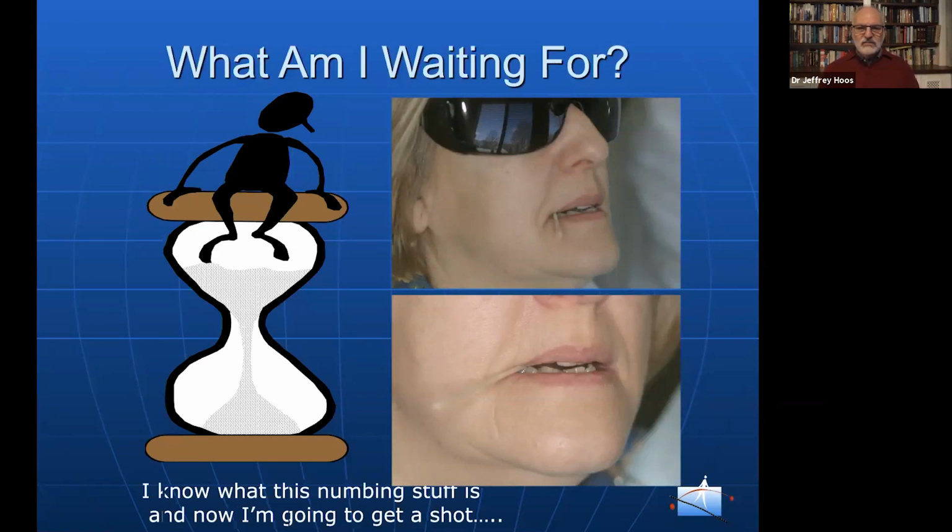But I noticed that she was sort of quivering a little bit. And if you notice at the stick, how it's sort of out of focus a little. And I said to her, Robin, what's the matter? She goes, I'm very frightened. I know I'm going to be getting a shot. Now think about this for a second. What the learned behavior here is. Topical leading to a shot.